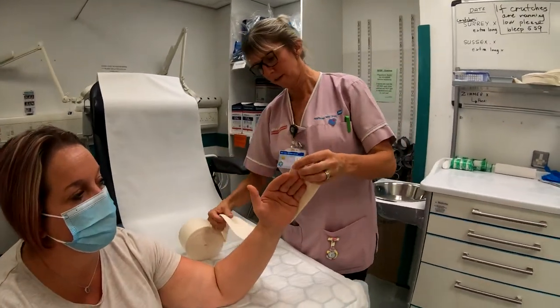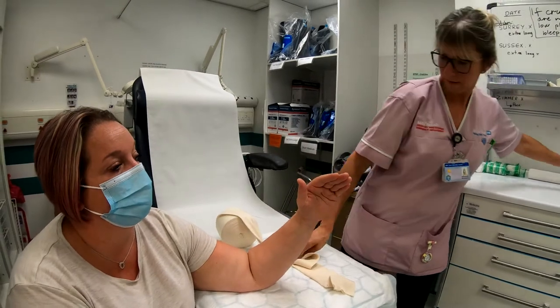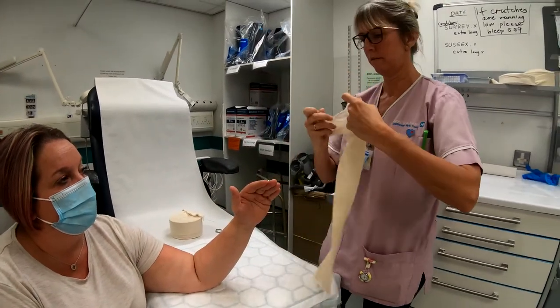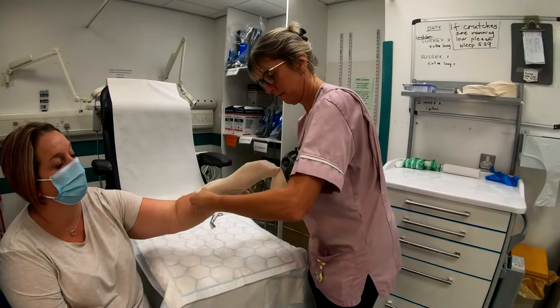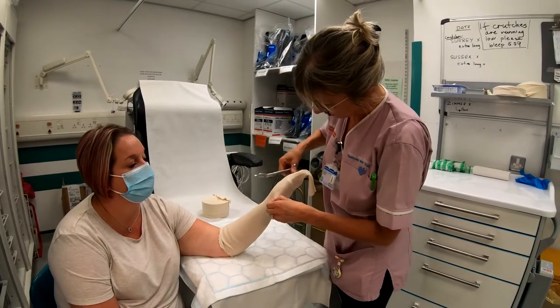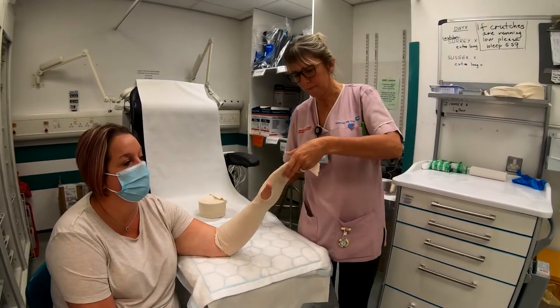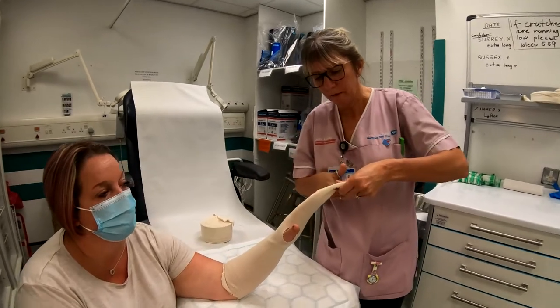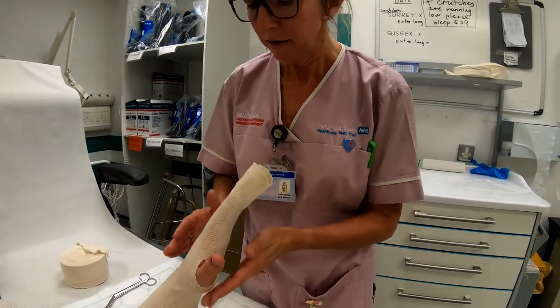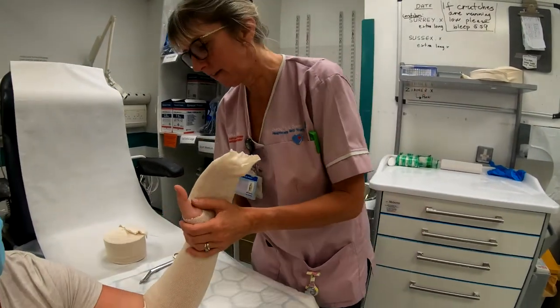We measure again from the tips of the fingers down past the elbow crease to ensure we have enough stocking net, then cut and apply it on. Again, make a hole at the base of the thumb. This time, make sure we have lots of stocking net left so we cover all the fingers — we don't do our cheese slice on this one, we keep it extended so that when we finish the cast we turn this back and you will just see the tips of the fingers.